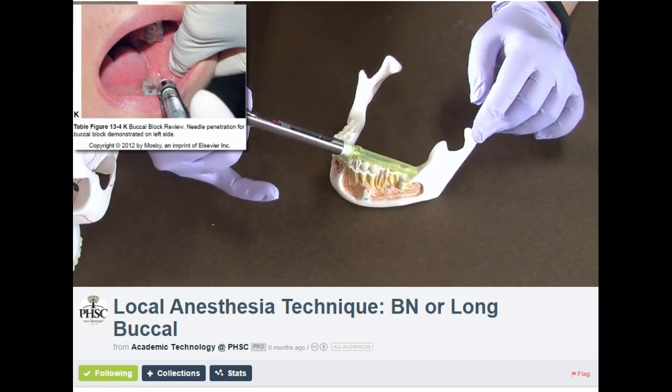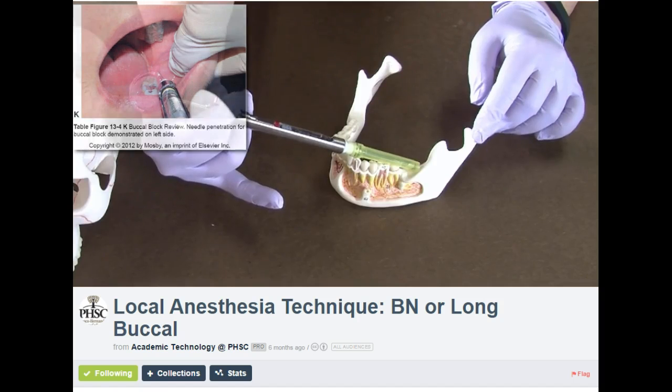The depth of penetration is one to four millimeters. You can use the same needle from the IA block, or a short needle if there was no IA block given. You want to deposit about one eighth to one fourth of a cartridge.